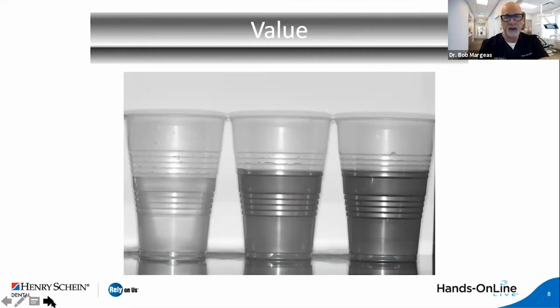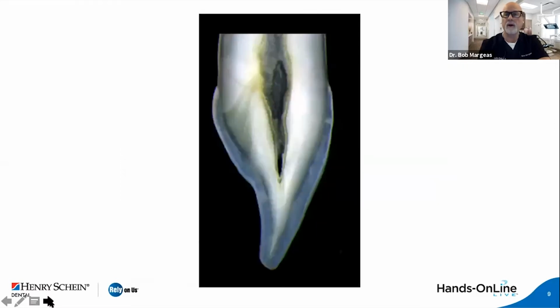Cosmetic Renamel, the hybrids and nanos have nice opacity, as does the dentin shade of, let's say, Filtech Supreme. There are a lot of composites on the market that are good. I just happen to like the handling of the particular composites I use, that being today Venus. And I'm going to show you exactly how we want that to be manipulated.